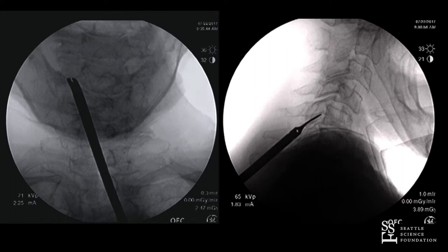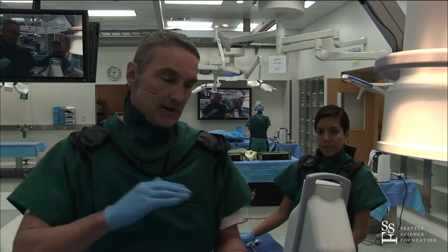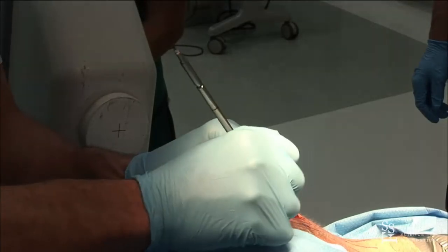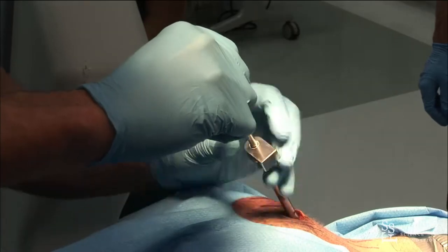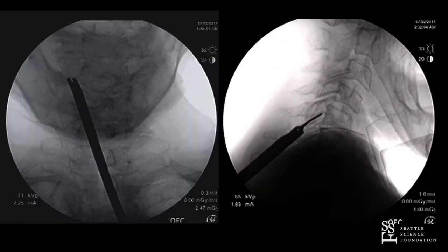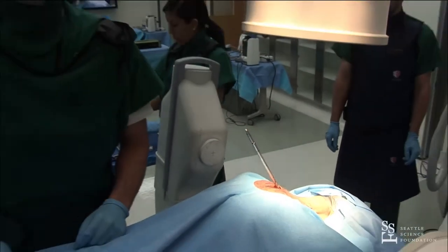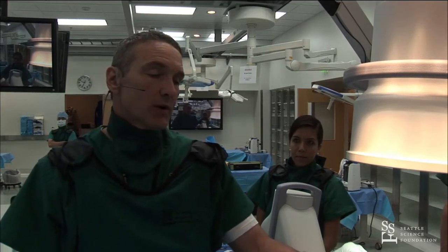This instrument is a trephan decorticator — or I call it a rat tooth decorticator. It's hollow. It fits over that post and allows you to decorticate the lateral mass. So this is put in over the joint; I can feel myself on the bone, I can feel it decorticating. I do the top and the bottom. So I've backed out a little bit — I'm just going to tap myself back in. Come up to decorticate the top, then the bottom. So on top of doing an inter-facet fusion in the joint itself, you're also decorticating the dorsal aspect of the lateral mass, correct? Yeah, that's the main entree — the posterior fusion.